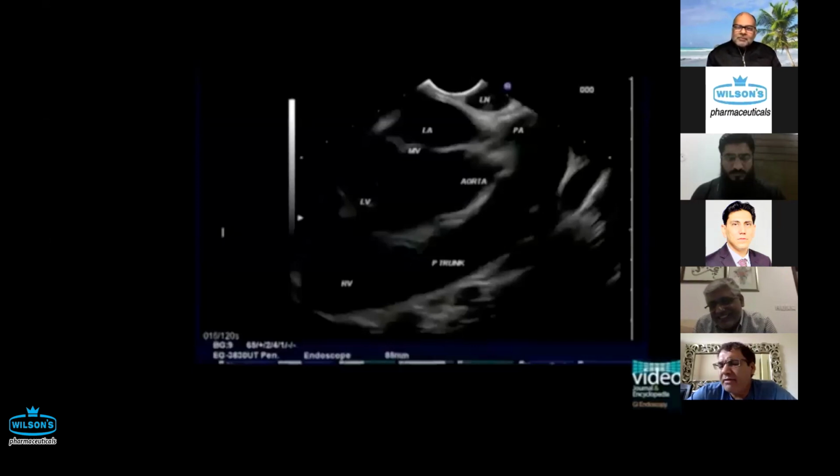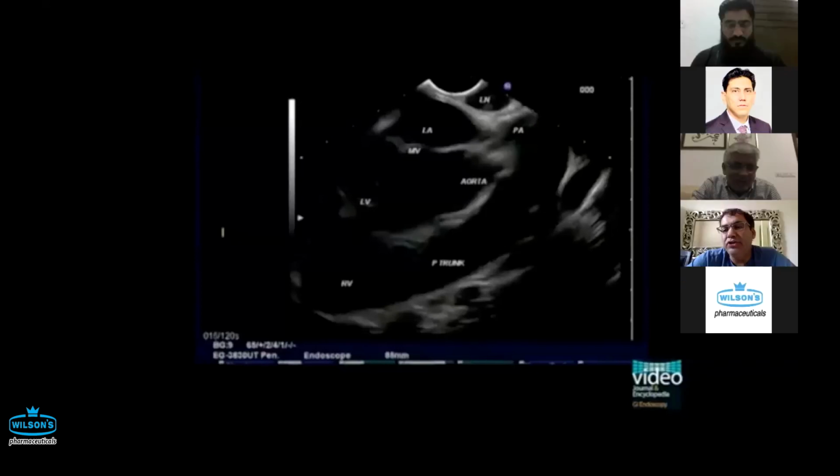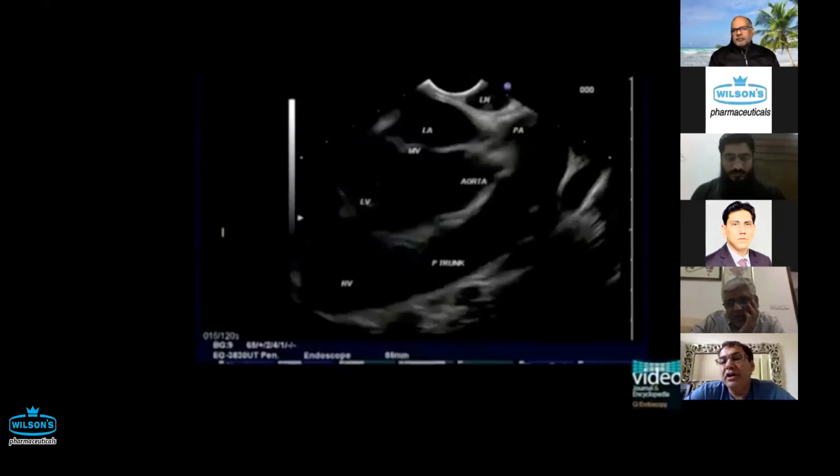And it's on the same lines. I have biopsied a tumor from the portal vein too. Because that's the only thing, they have to differentiate whether it is really a thrombus or a tumor thrombus. But then you've got a thrombus there, right? No. There are two. If there is a tumor there, is it a tumor penetration? No. What I mean is that you have a structure within that portal vein, so that also helps. Oh, absolutely. Yeah, and you see it's a structure in there. So they had to differentiate if it's really a vascular thrombus or a tumor thrombus.